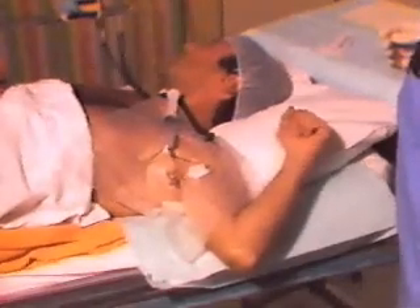the searching current should be near 3 milliamperes. At contact, it should drop below 0.5 milliamperes. Lower stimulation in the axillary and upper arm region evokes simpler movements of the hand and forearm.